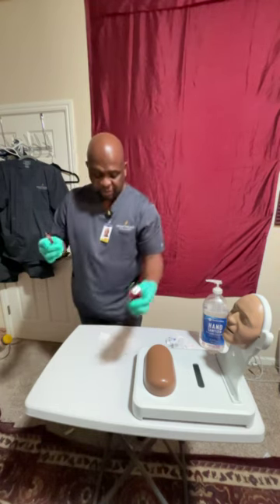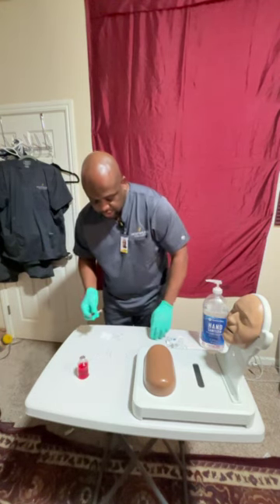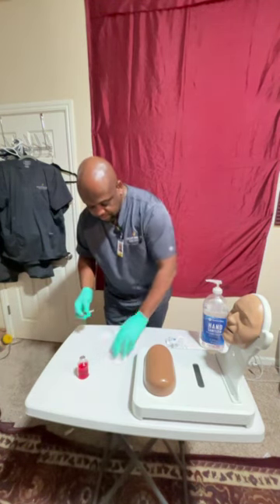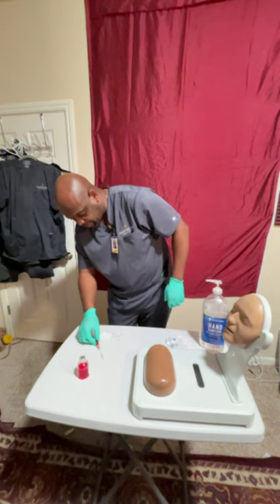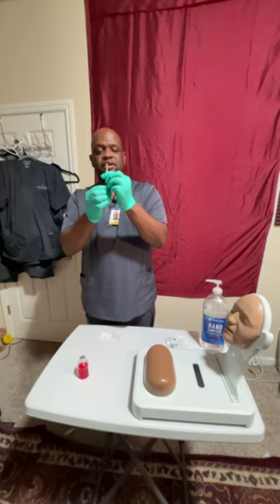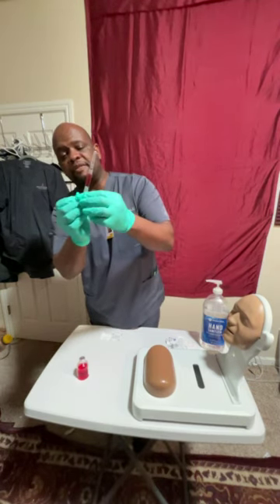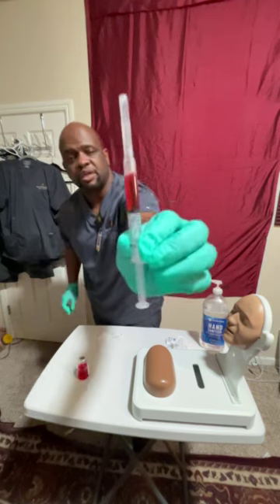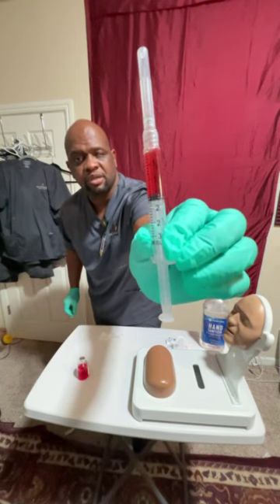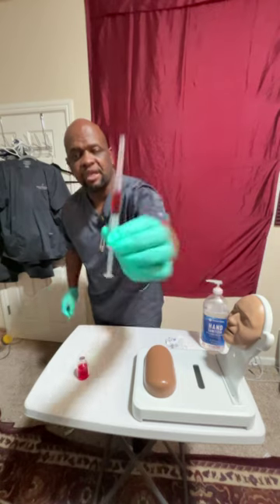And because I still have to prep the patient, I am going to do a one-hand scoop to recap the syringe for safety reasons, so I don't have to worry about poking myself. That's back on. And I'm going to show you the 1.5 mLs of what I just drew up. 1.5 mLs. All right. Okay, good.